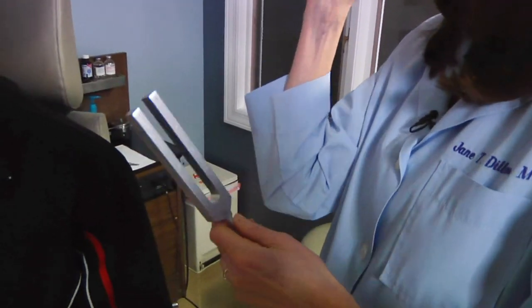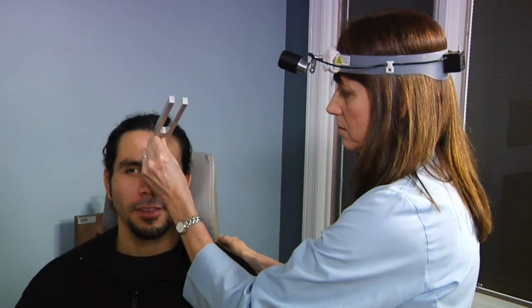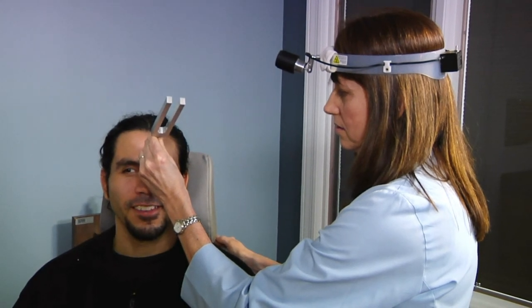Because the inner ear cannot be seen, a thorough history is extremely important, as well as any other additional information that would be gathered. This is true for both neurosensory hearing loss and vertigo. Tuning fork evaluation of the ear may be done, but is often of limited value. In the Weber test, the tuning fork is placed on the forehead, the bony nasal dorsum, or the front teeth. Ask the patient to tell you whether they hear the sound louder in one ear or the other, equal in both ears, or they cannot localize the sound. Classically, the tuning fork is louder in the better hearing ear in a neurosensory hearing loss, and in the worst ear if there is a conductive hearing loss on that side.